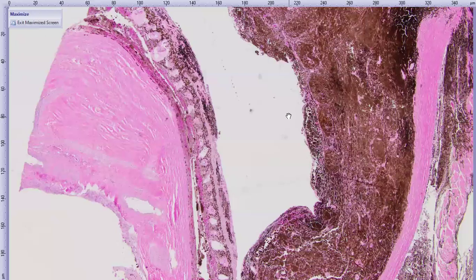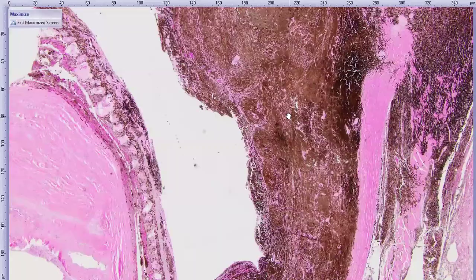So this is what we call an atypical melanoma, because it does not share features with the vast majority of the feline diffuse iris melanomas. So in Coplow, we call this an atypical melanoma. Despite the bland cytologic features, these do metastasize, possibly at a higher rate than the normal iris melanomas. However, we haven't done the study or gotten the follow-up to really confirm that, but we do feel that these have a higher malignant potential, a higher metastatic potential, than the feline diffuse iris melanomas, or the vast majority of those tumors.